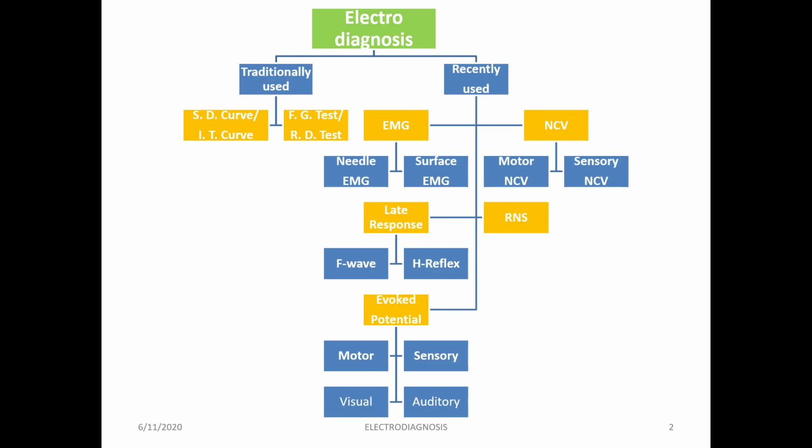Okay, so now coming to EMG, that is electrical activity occurring in muscle. It includes needle EMG as well as surface EMG.